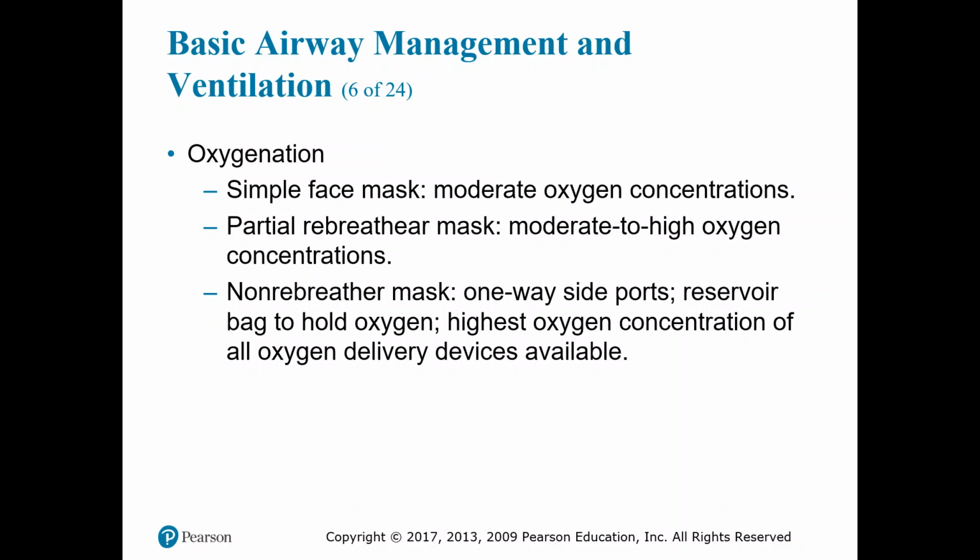That's why we continue to monitor our patients, not only O2 saturations, but end-tidal CO2 levels and their physical signs. Are their respirations adequate? Are they deep enough? Is the rate appropriate? Is it too fast? Is it too slow?